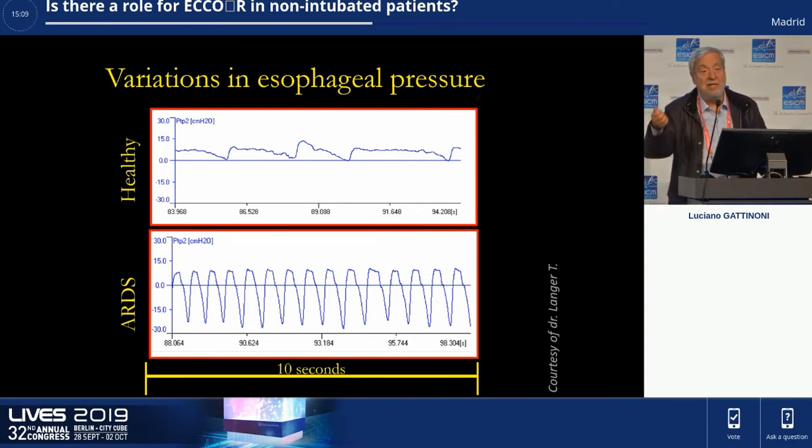That means I increase CO2 removal 50%, decrease CO2 production 50%, but look what happens when you start to do this in a spontaneously breathing animal. That means you may maintain the CO2, but you have a tremendous drive, as Laurent said before. The brain does not accept this.